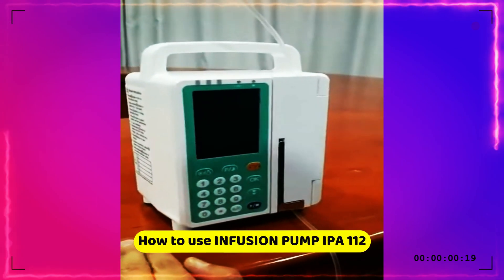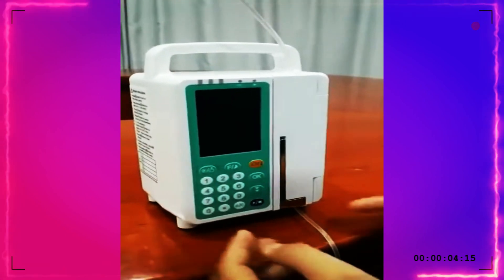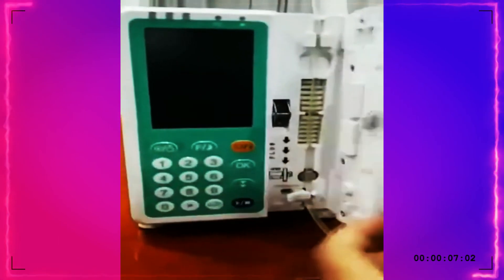Now I'll show you how to use the infusion pump. The first step: install the IV set and close.